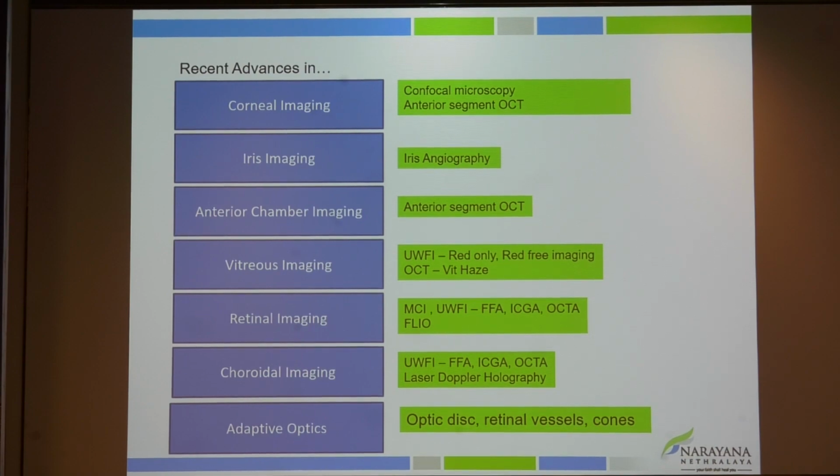In retinal imaging, we have multicolor imaging and also ultra wide field imaging, FFA, ICG, OCTA. Recently, we have fluorescence lifetime imaging ophthalmoscopy, where we can do a modification of the autofluorescence imaging. Coming to the choroid, enhanced depth imaging has been used to study the choroid in depth.